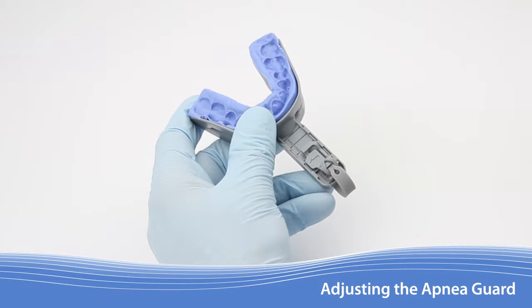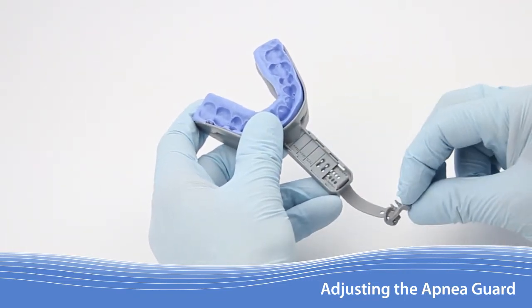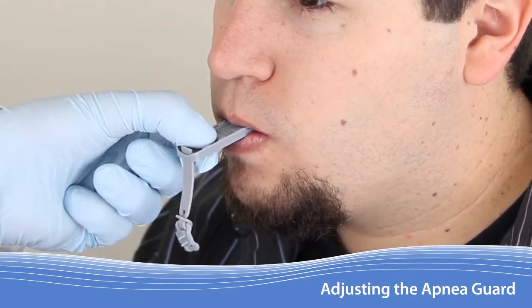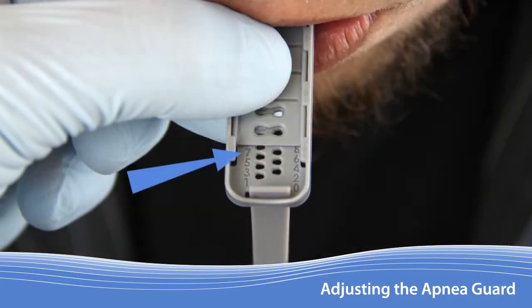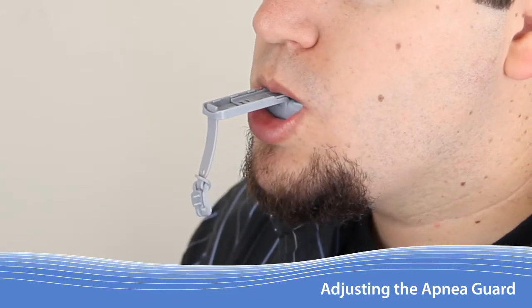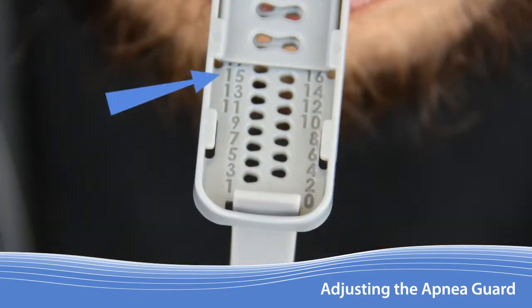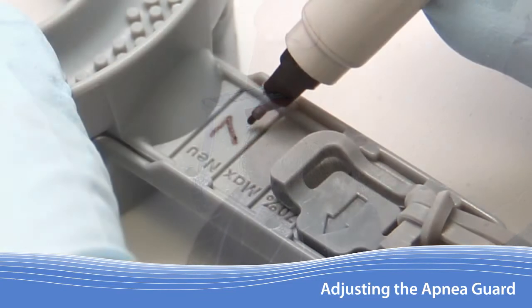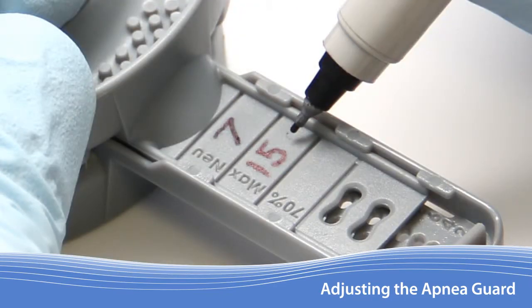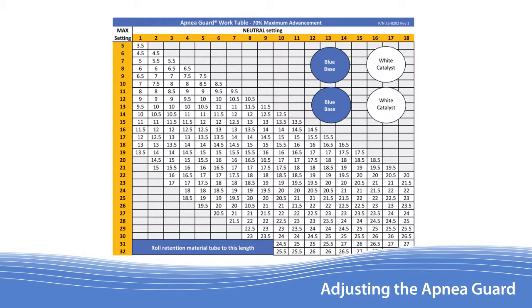In most cases, the Apnea Guard is now fitted. With both trays molded, the Apnea Guard is now ready to be adjusted. Begin by removing the lock so that the trays are allowed to slide freely. Ask the patient to insert the Apnea Guard and relax their jaw while tapping lightly several times to achieve the neutral jaw position. Looking down on the handle, note the first fully readable number after the edge of the top tray — this is their neutral jaw setting. Write the number down. Now ask the patient to protrude their lower jaw forward as much as possible — this number is their maximum setting. Obtaining these measurements should be repeated to ensure consistent results. Ask the patient to remove the Apnea Guard and, with a narrow tip pen, write the neutral and maximum values on the upper tray handle. Next, refer to the Apnea Guard work table to calculate the optimal advancement setting.